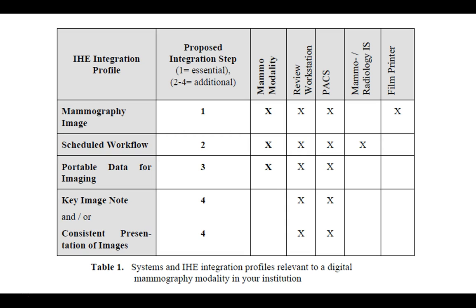So here you have mammo image, scheduled workflow, PDI, KIN, and CPI. And this table shows what they are, how essential they are, what they do.